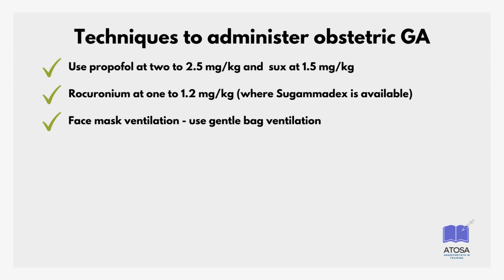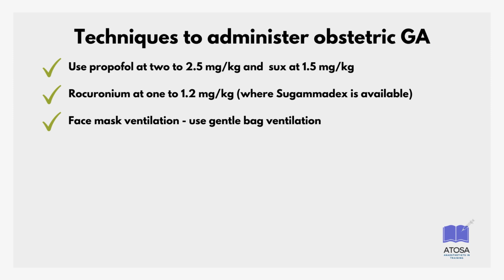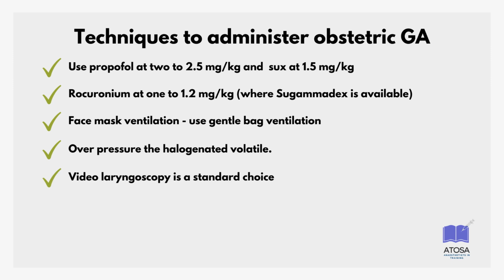Face mask ventilation. I use gentle bag mask ventilation. Remember, it's 20 centimeters of water or less, and the patient is gently mask ventilated post-induction but prior to intubation. I then overpressure the halogenated volatile, remembering that I'm trying to mind the gap and reduce the risk of awareness. Videolaryngoscopy is my standard choice.